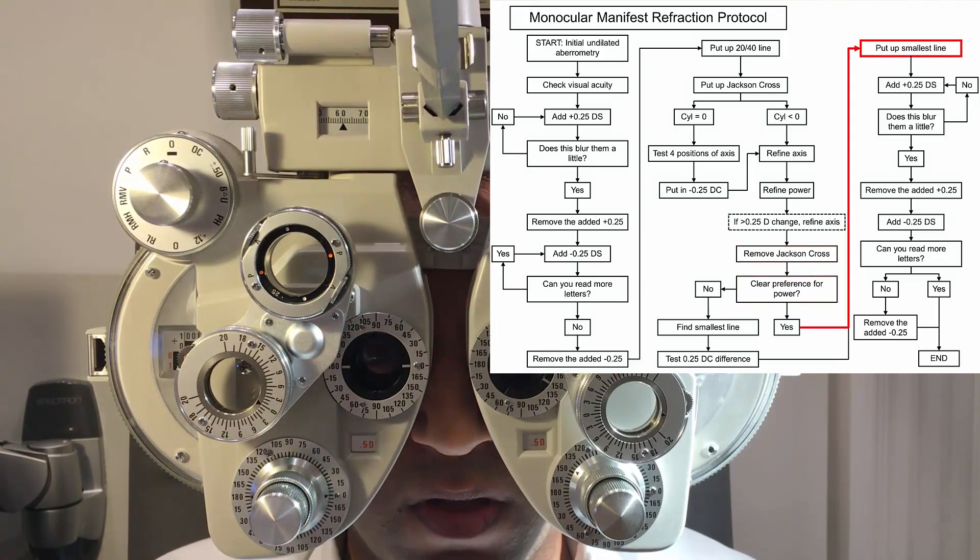The smallest you can see there? S, Z, R, D, N, and then H. Any more on that H line?